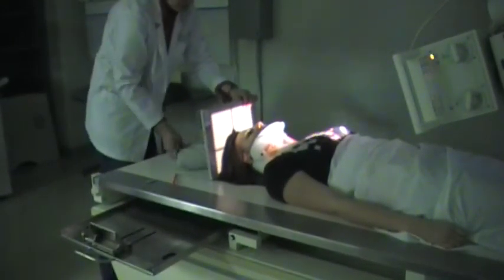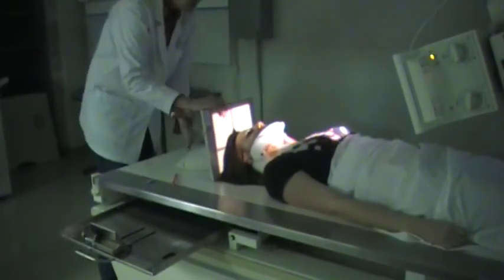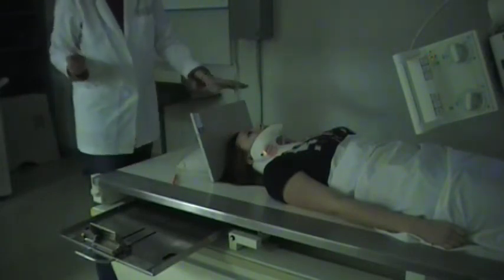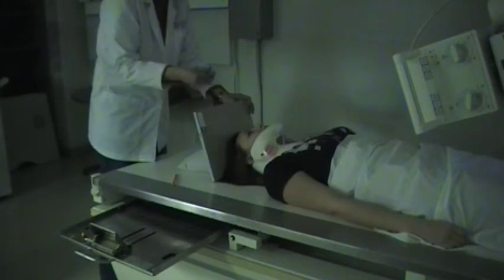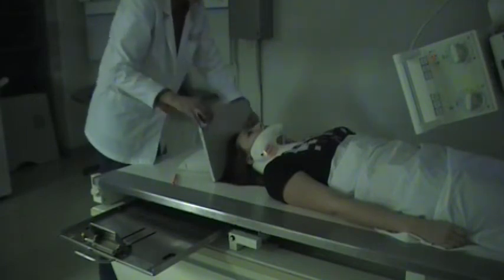And I'm going to go ahead and prop this image receptor at the top of her head here. I'm going to go ahead and mark her arches. Now we are getting the right and left arch. So I have my left marker in my hand, and I'll place it to the left side of her face.